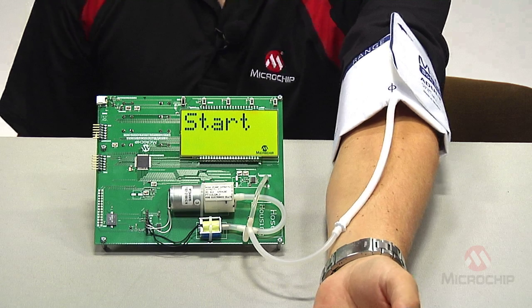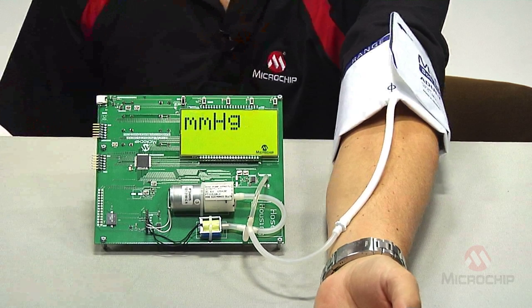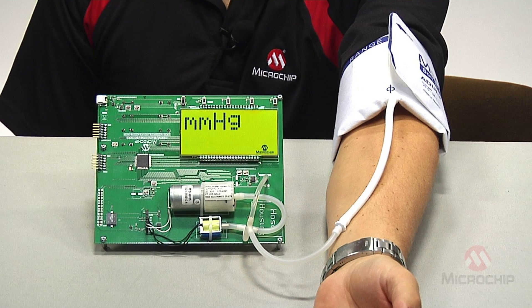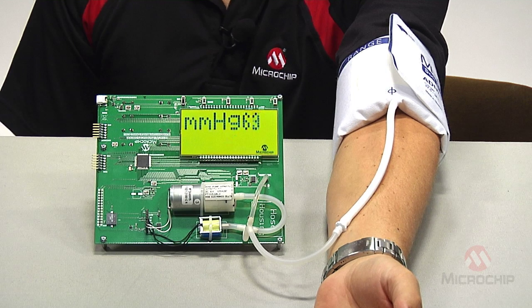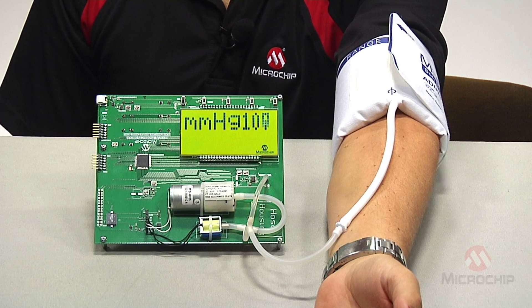I have the cuff on and once I press start, you can hear the pump start up — it's filling up the cuff. Now it has my pulse and it's going to start backing the pressure off.